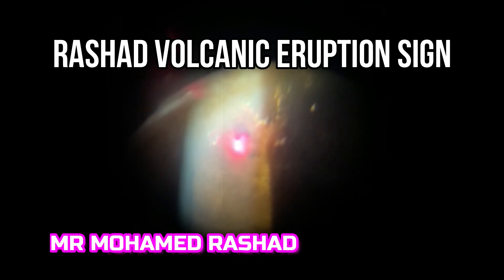This is another case of angle closure with a brown, thick iris. You examine as well, and you may add some argon laser before the YAG in these cases. After some attempts we have a small opening as shown by the arrow. Now you have the Rashad volcanic eruption sign — the gush of aqueous and pigments — confirming full thickness. Then you can enlarge the opening a little bit.